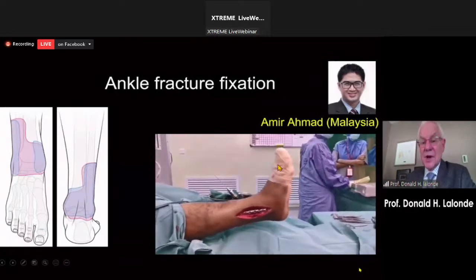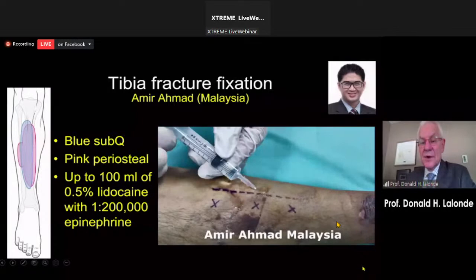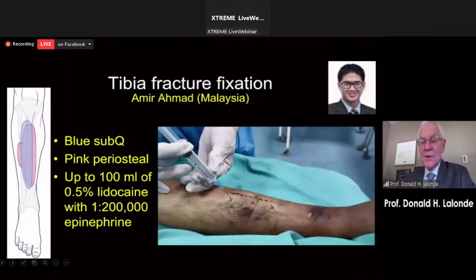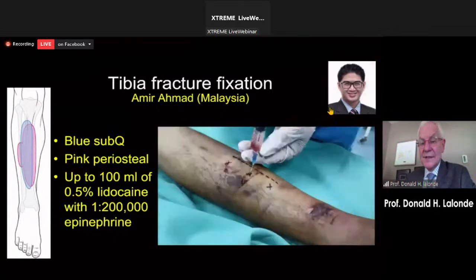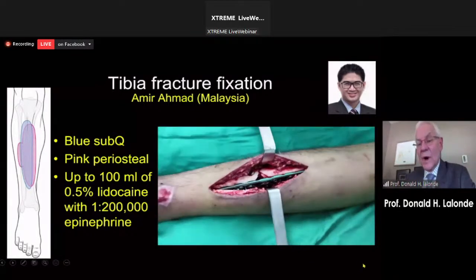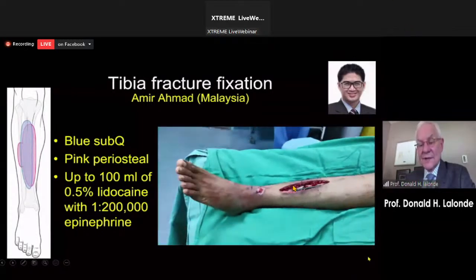This is Dr. Ahmad doing a tibia fracture fixation. I'm showing you all these surgeons because I'm not an orthopedic surgeon. I'm a plastic surgeon, so I don't do this surgery. But orthopedic surgeons all over the world, in the United States and South America and Asia, have started doing long bone fractures wide awake. And the morbidity is less, the cost is less, it's much safer than general anesthesia.